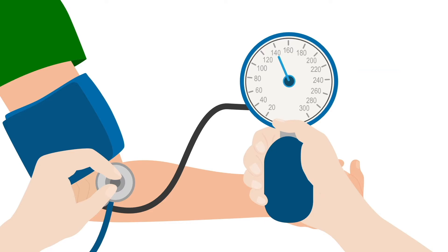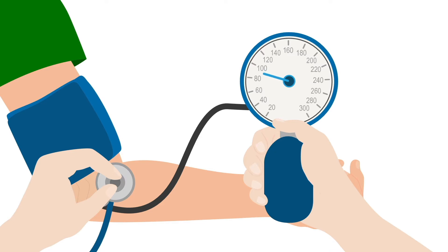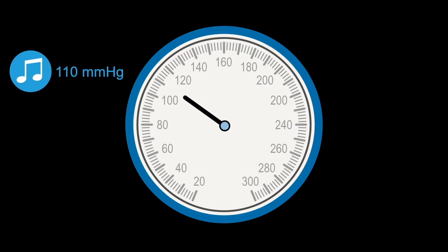As I continue to very slowly release the pressure, I'll see the needle bounce with each heartbeat, but there will not be a sound with every beat — only intermittently. Then we see the needle bouncing but don't hear another sound until around 110 mmHg.